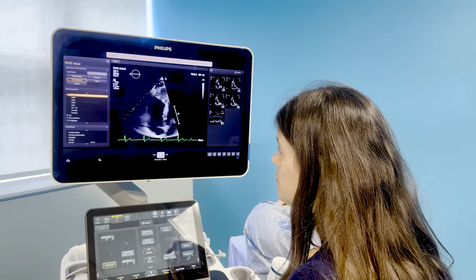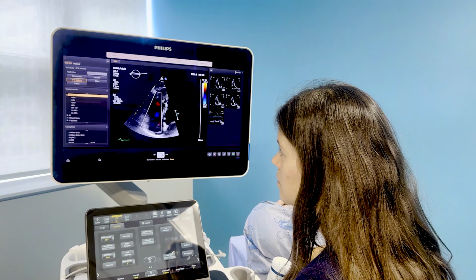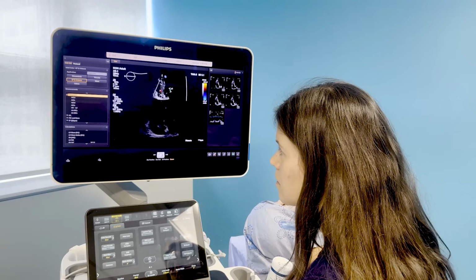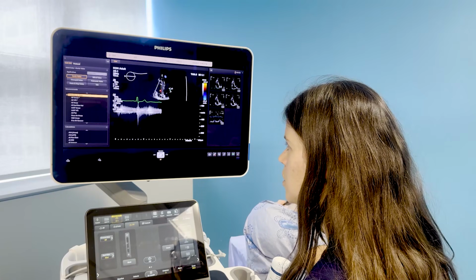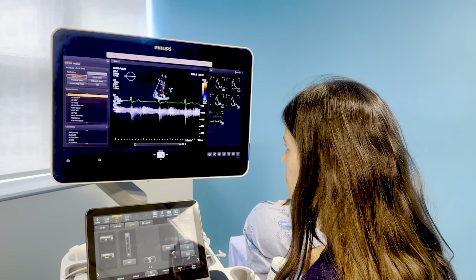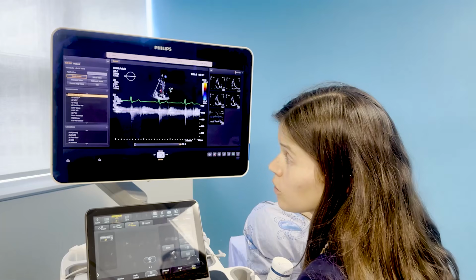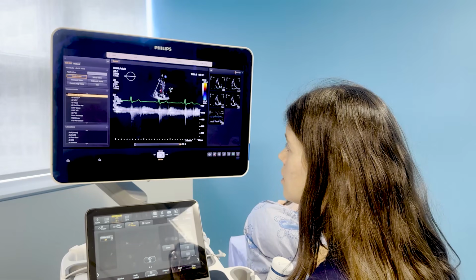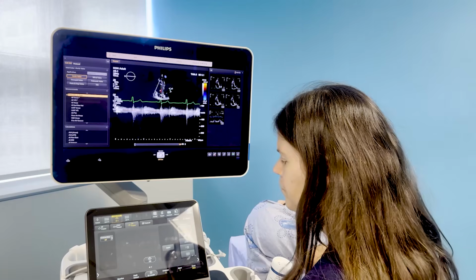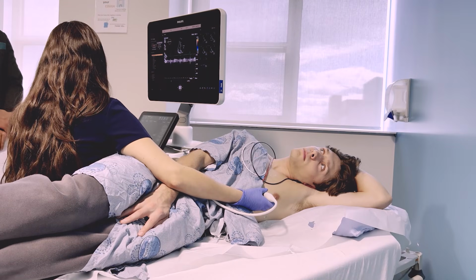And in this case, we're not really seeing findings consistent with pulmonary hypertension, so you may not proceed to do that. Correct. So I wouldn't do that measurement in this instance. Okay. But of course, you're looking for the tricuspid regurgitation everywhere you can in every window, trying to get a nice jet. Okay. Why don't we talk a little bit about the eccentricity index next?